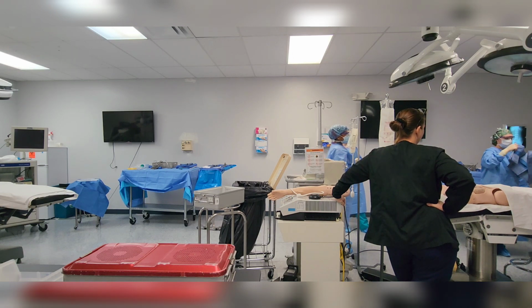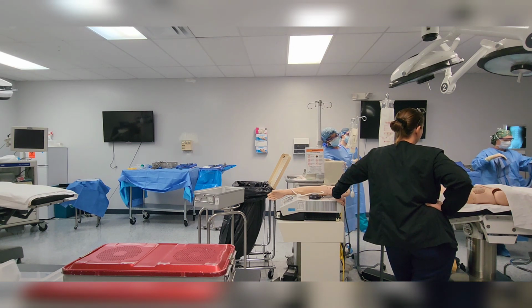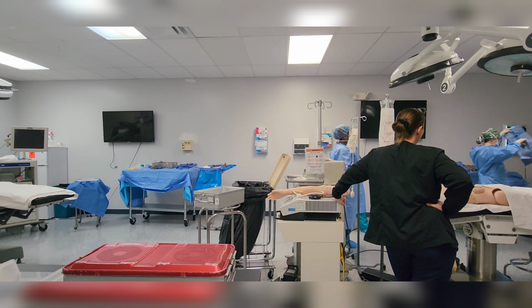So you're going to come on this side, right? But again, you're going to find surgeon preference. No, don't let that drop too low. Remember, just let them think it's.